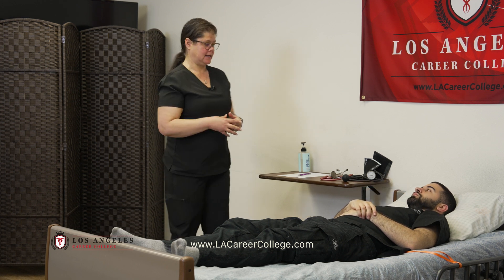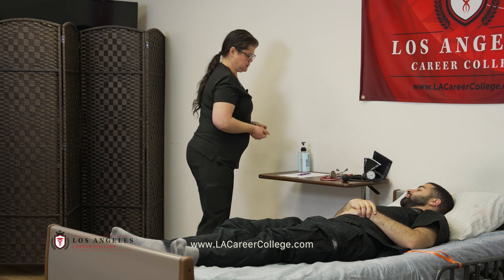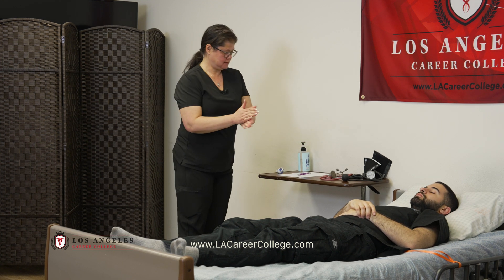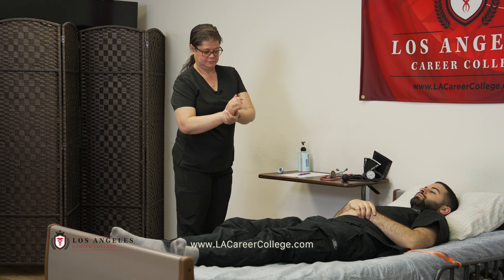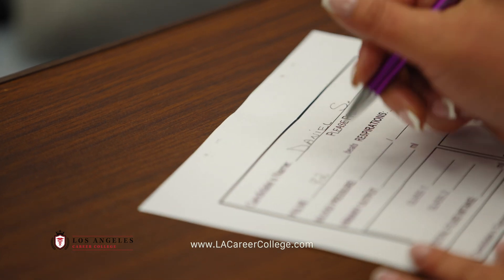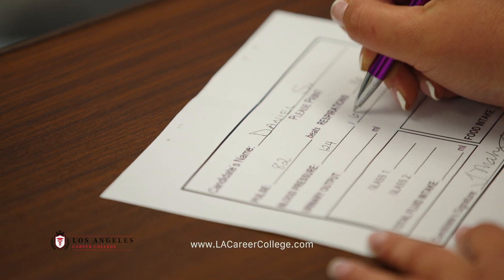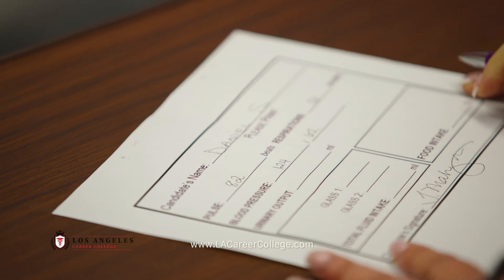Normal adult blood pressure is higher than 90 over 60, but lower than 120 over 80. I will now write my result after sanitizing my hands, rubbing together until they are dry. The resident's blood pressure is 124 over 62. This is normal.